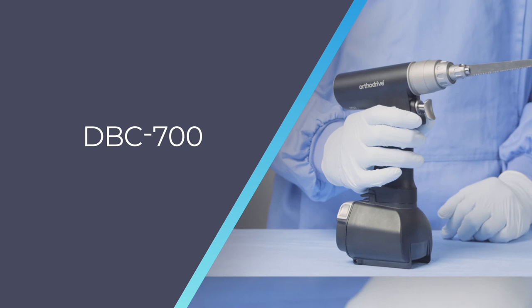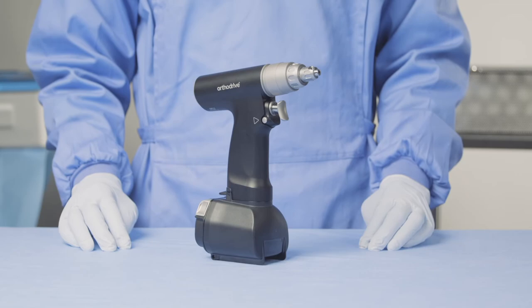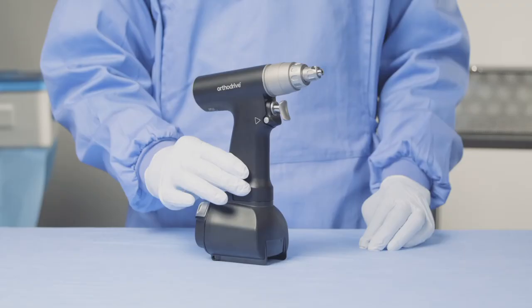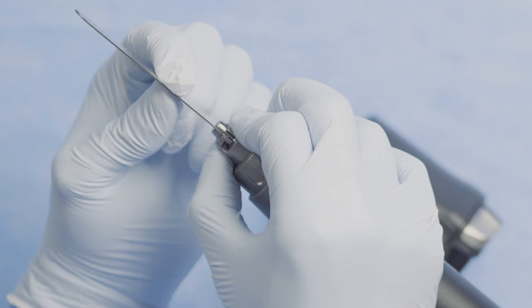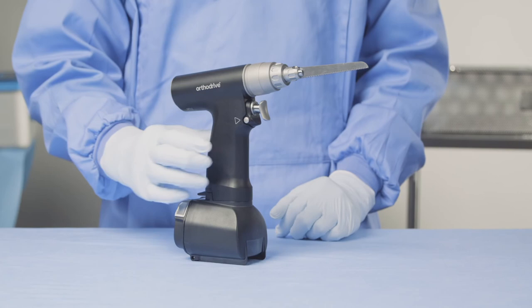If you've opted for a three handpiece system, you will have a DBC 700 reciprocating saw. This is compatible with our S84 blade range. Before inserting a blade, make sure the tool is in safe mode by making sure the mode selector is in the central position. To insert your S84 blade, simply twist the small collar at the front of the tool and slide the blade into place. Release the collar to lock the blade. With the blade in the locked position, I can push the mode selector to either side to run the tool.